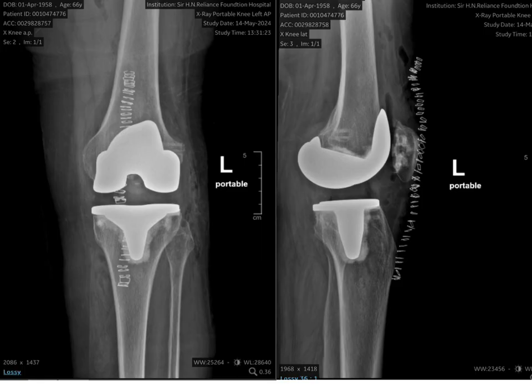We also changed the poly to a thicker poly, and this is how it looks now. You can clearly see on the femoral side there is a track for the screw, which is the bio screw used for reconstructive PLC. So sometimes we have to look into what can be done, and this is a 1-year follow-up.